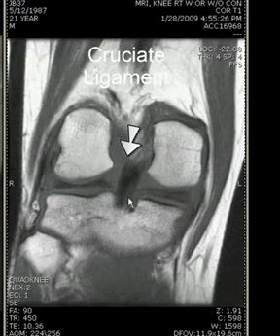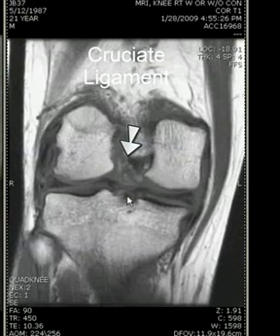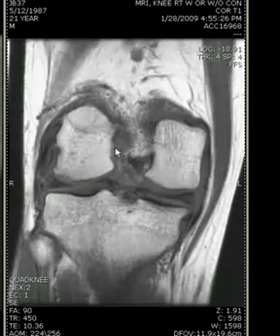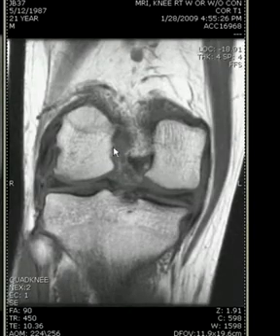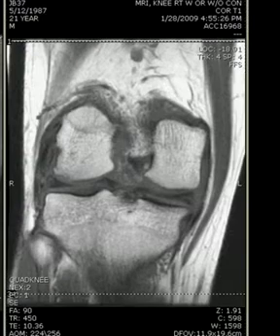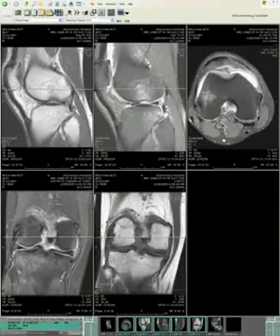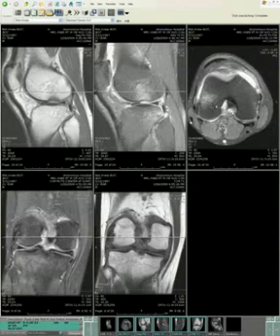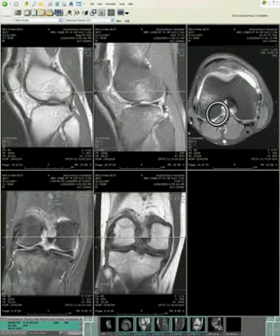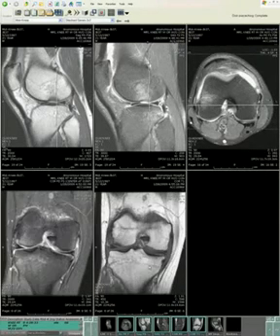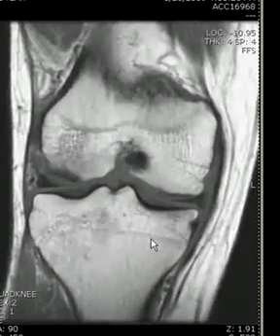We want to make sure we are dealing with the same abnormality in multiple planes. The posterior cruciate ligament again is intact on the coronal plane. As we move into the anterior cruciate ligament, we can see marked high signal intensity against the femur, and we can match that with our axial images, where we can see extensive high signal representing the full thickness tear of the proximal portion of the anterior cruciate ligament.